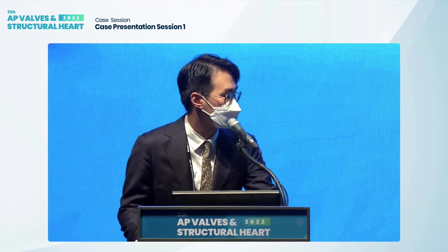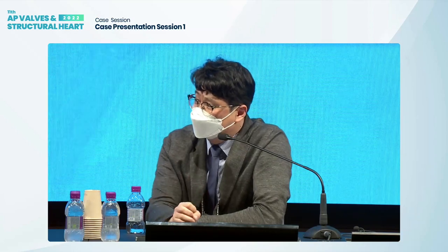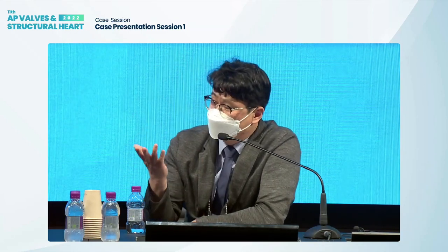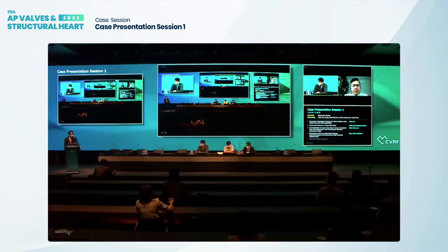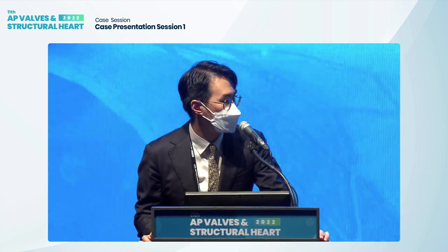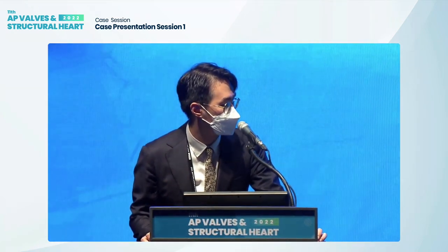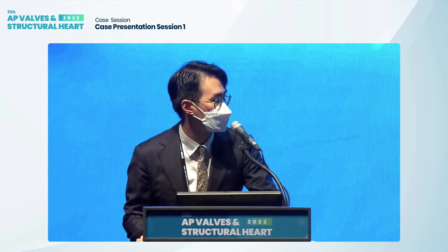Okay. In this situation, patients have two simultaneous disease entities, the aortic stenosis and severe mitral regurgitation. So valve insertion depth is more important, because a deeply inserted valve may cause more aggravated mitral regurgitation. So how do you decide the valve height? Especially in the bicuspid aortic valve, using the high implantation, so we routinely use it as the routine procedure.